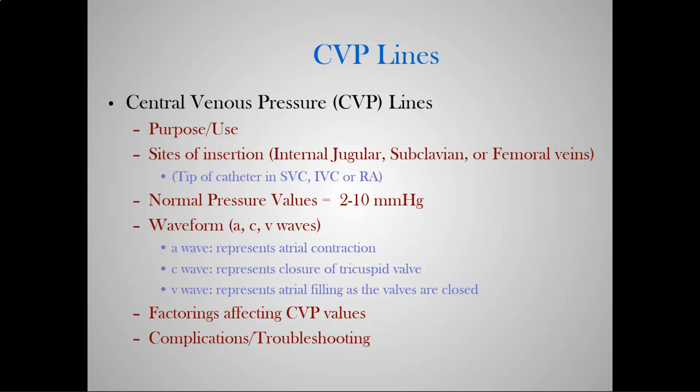And just like the arterial line, the CVP is the same exact line set. Pressure bag, everything. Transducer, all of it's the same. The only different part of the CVP is where we are measuring and where that catheter terminates. Whereas an arterial line is in an artery, and we are measuring the actual pressure in an artery second by second, we are measuring, in this instance, the volume in a central line, typically the right atria, and we are monitoring that value.